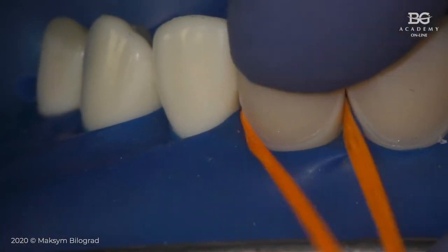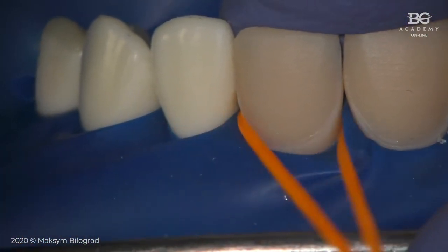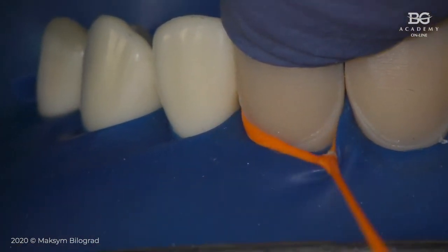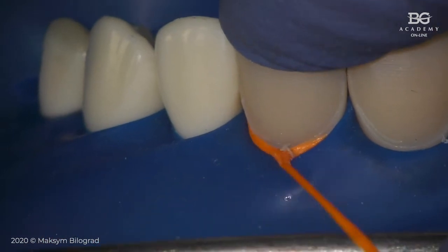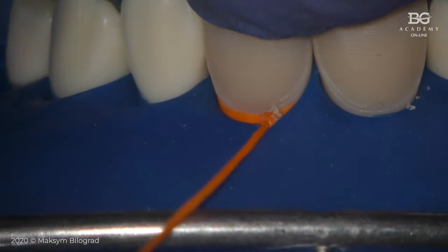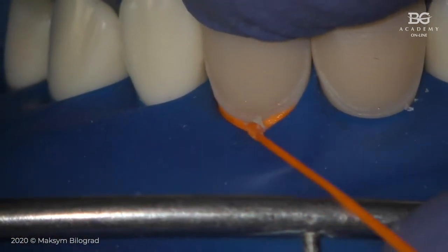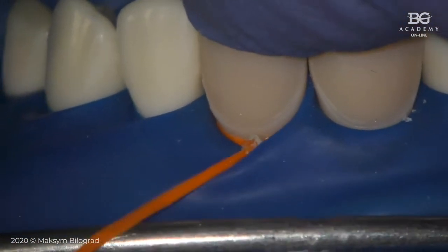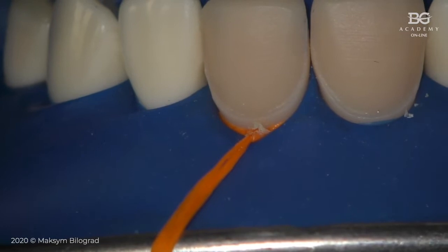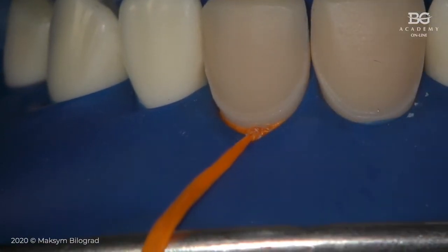You can use floss ties when you have a pretty extensive or big palatal bulbosity on the tooth, and your prep is at gingival level or supragingival definitely, or intracervicular just at the beginning of the sulcus. In this case, you may use floss ties in easy ways. Look, now we have the finish line pretty much exposed by the floss tie.